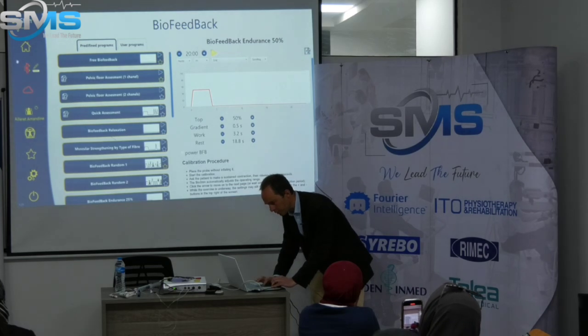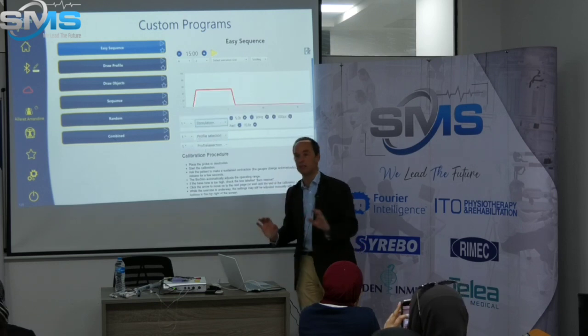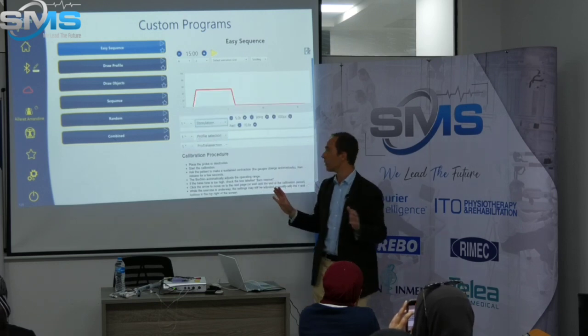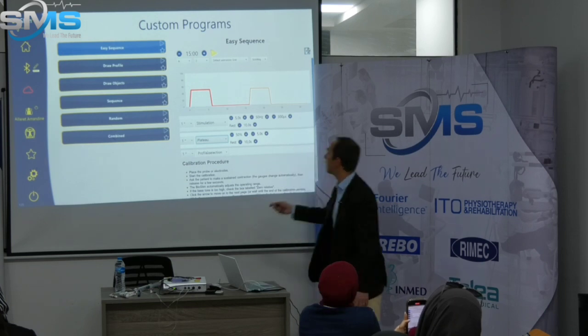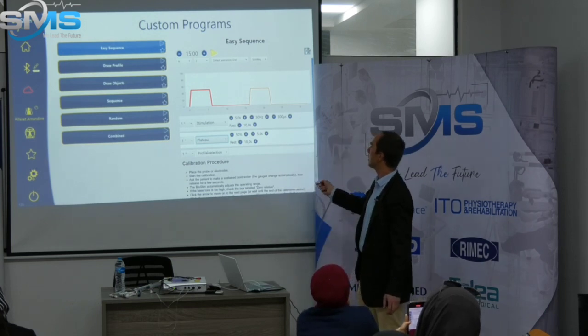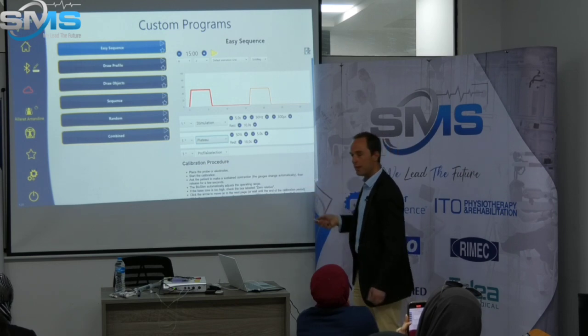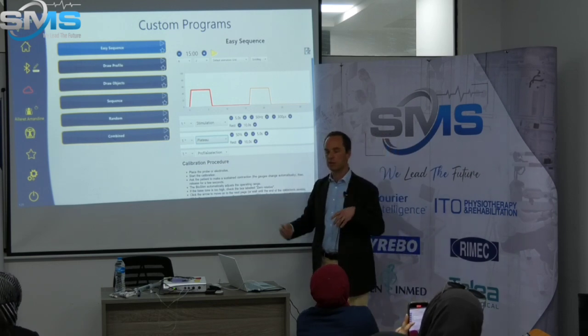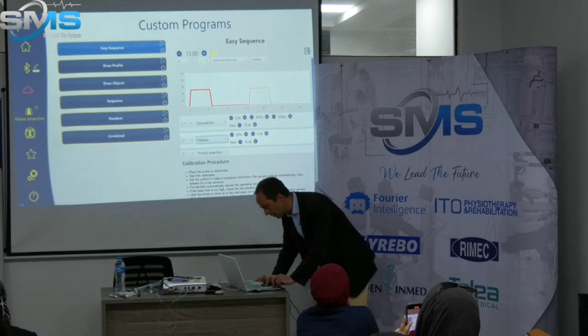Let me show you how it works. Here. I will tell my patient that she will start with stimulation, as we already saw, and then just after, she'll do some biofeedback. You can see here, it is bold, it is stimulation. Here, it is thin, it is biofeedback, and we'll do it again and again and again. The interest is that with stimulation, she can feel which part of the body is contracted, and after she can try to do the same by herself.